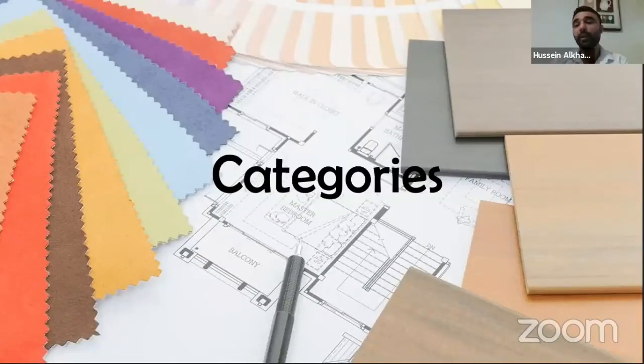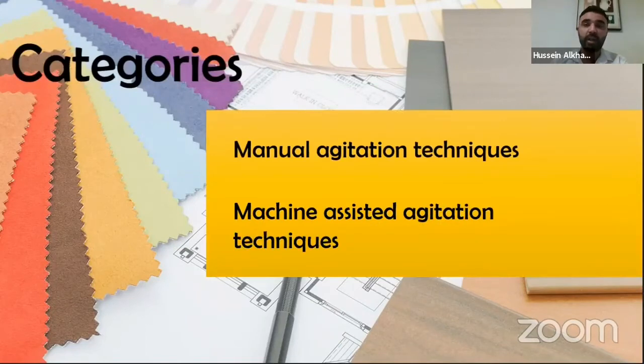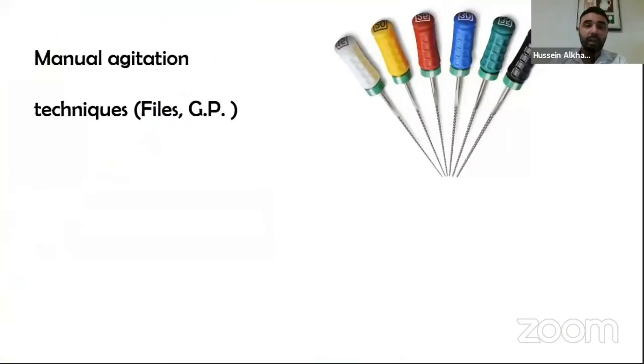Now, what are the categories of agitation or activation technique? We have two categories: the manual agitation technique and the machine-assisted agitation technique. For the manual agitation technique, we simply can use endodontic files or gutta percha with a simple up and down movement after we soak the canal with the irrigation agent, so that we are increasing the activity of the irrigation solution.